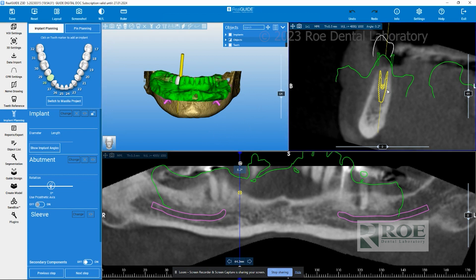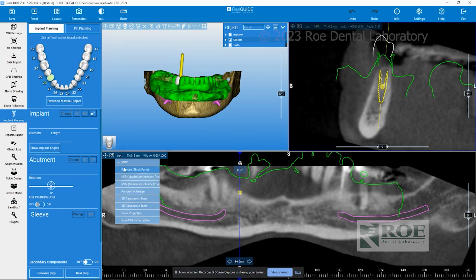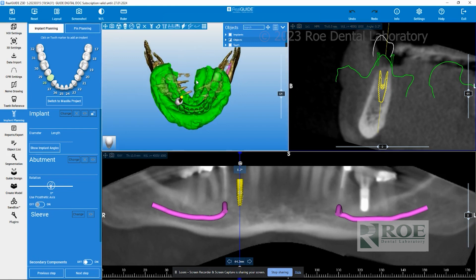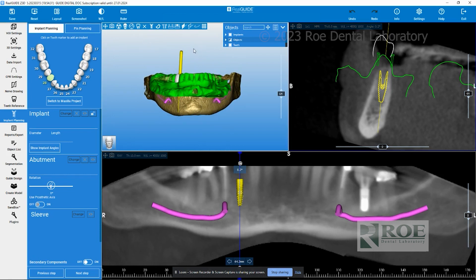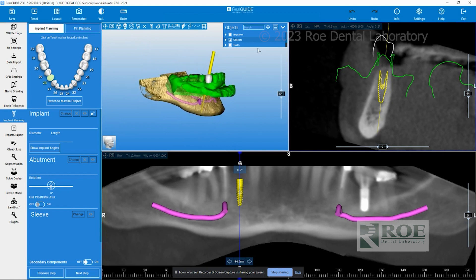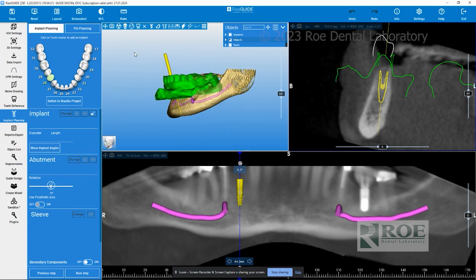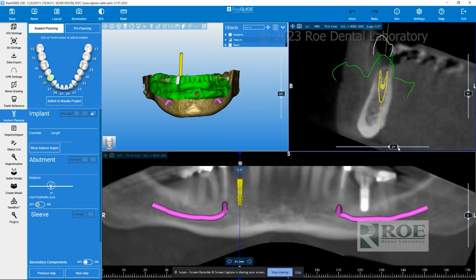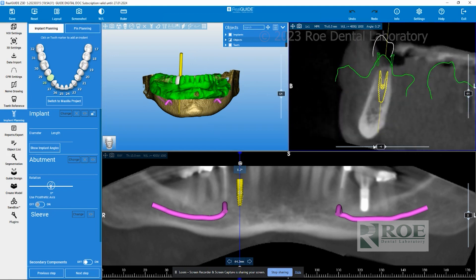Once the plan is open, you have a couple of windows to view. You have your panoramic — for a better view, click on the button that says MPR and switch it to Raysom for a much clearer view. You also have your three-dimensional view, which can be moved around by clicking and holding your left mouse button up and down or left and right. The third window is a sagittal view that allows you to go around the implant in a 360-degree view.